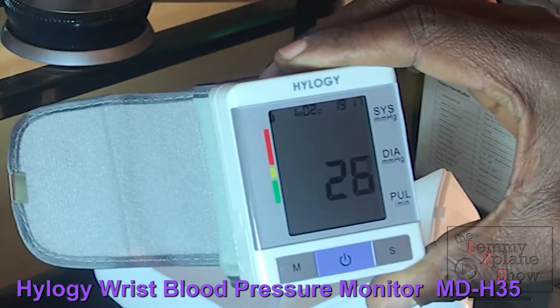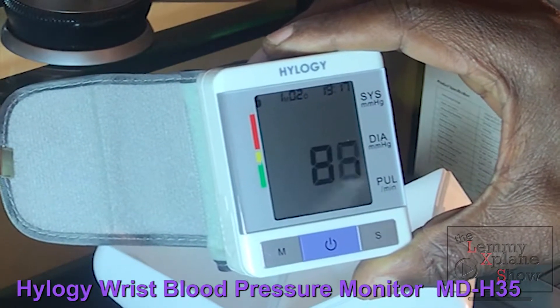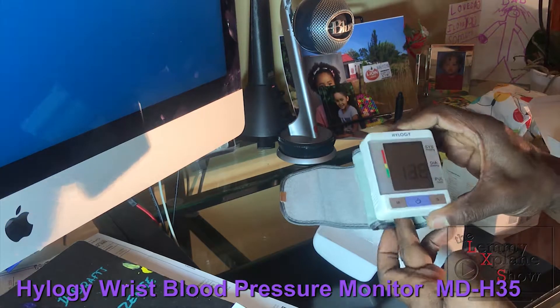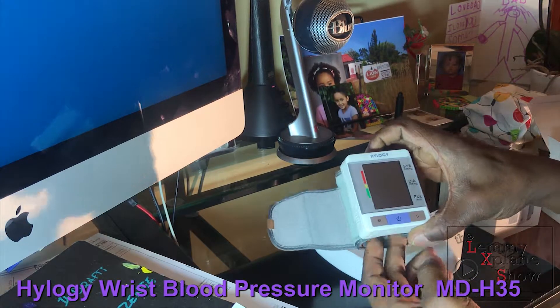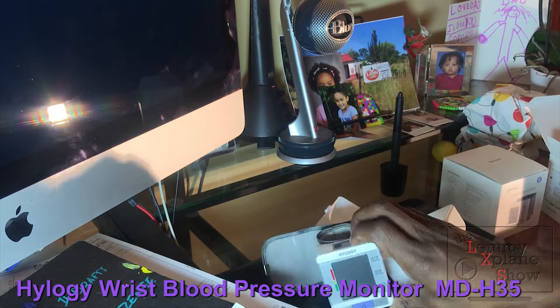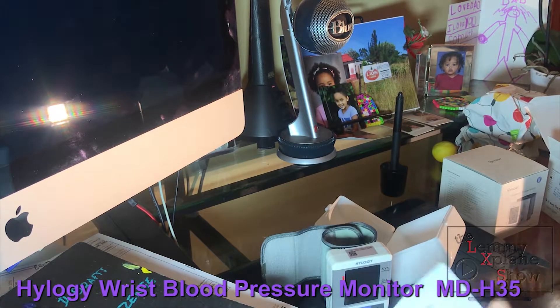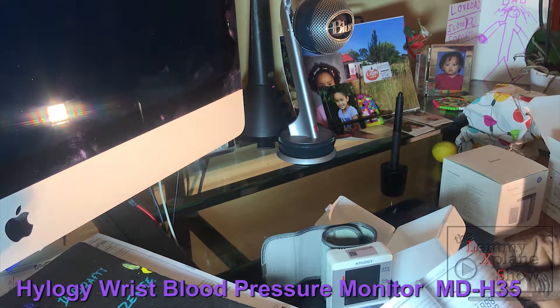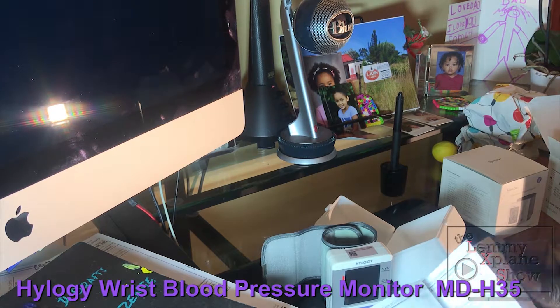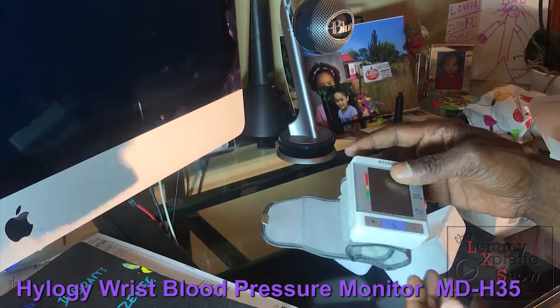Off the bat it's already trying to measure, so I'll just turn it off because it's really pumping up. First, let's look through the manual and see how you actually work the device.